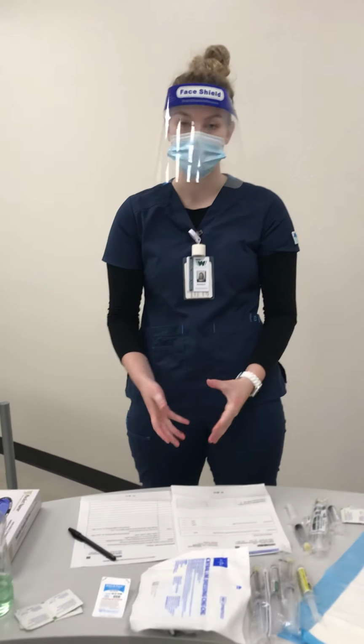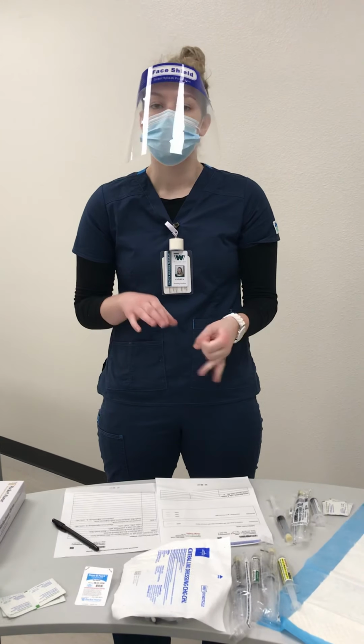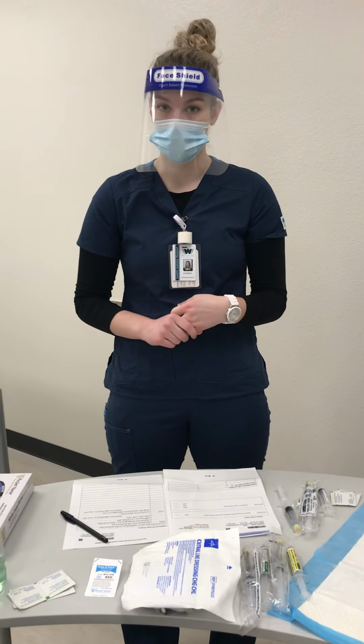Hi, my name is Andrea Green, ADN student at Loyola State College, and today I'm going to be demonstrating skills regarding central lines. This includes a blood draw, dressing change, and administering medication through the central line.